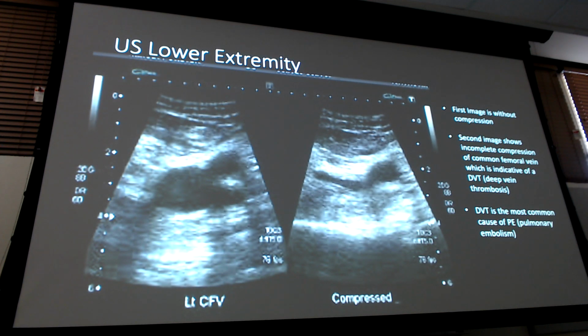Yeah? How much concern do you have for dislodging it? Yeah, good question. How much concern do you have for dislodging? Not as much as I have if I don't find this and misdiagnose it. Is that a possible risk? It is. But it's not as great of a risk as not realizing they have this. Because if they had it, guess what I'm doing now? I'm treating. And you're going to learn what that treating is. It's going to be with anticoagulants. You're done. You don't have to give radiation. You don't have to give contrast. You've just diagnosed, and now you're treating them.